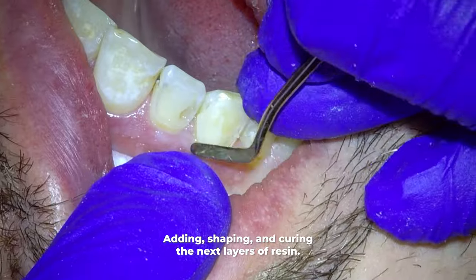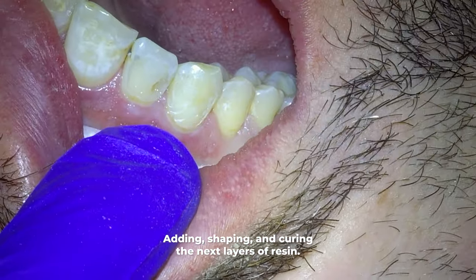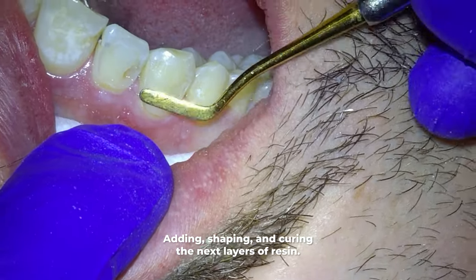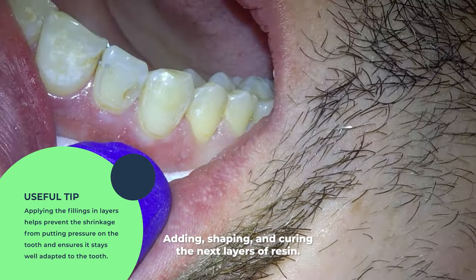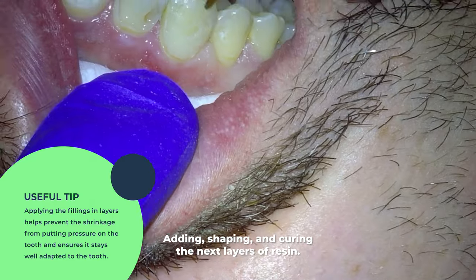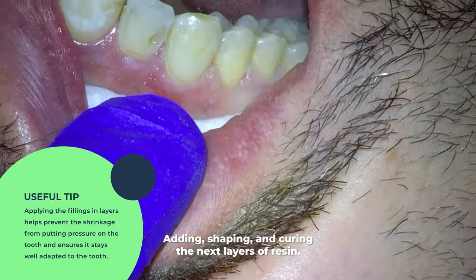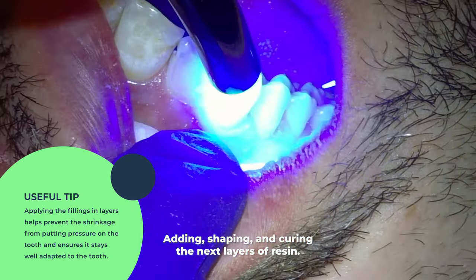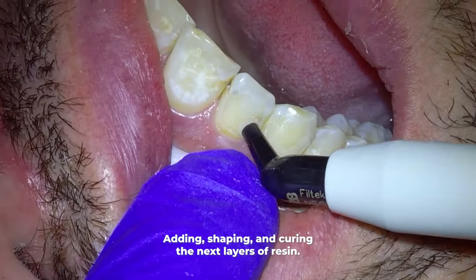Before adding that second layer, it's important to understand why we do it. When you light cure a resin it actually shrinks about one to five percent. Doing it in layers doesn't stop the shrinkage from happening, but it stops the shrinkage from causing all the bad side effects it might put on the tooth. So there will be less likelihood of sensitivity on the tooth afterward, and it also ensures that the resin filling is well adapted to the tooth even after the shrinkage.